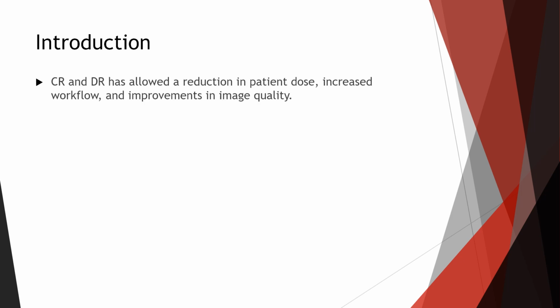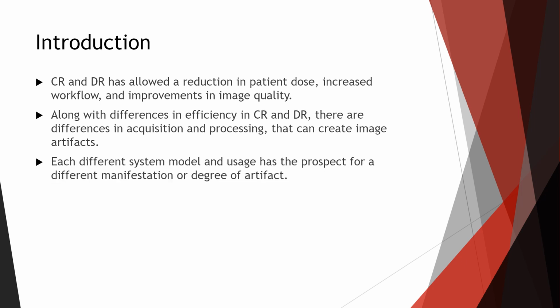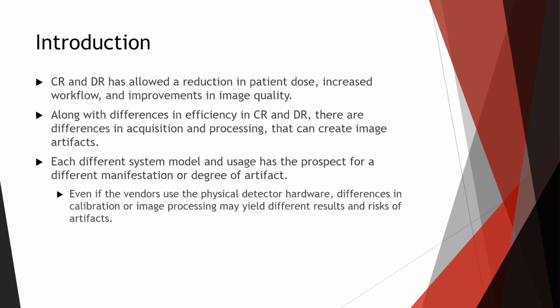We'll go through an introduction. CR and DR have allowed a reduction in patient dose, increased workflow, and improvements in image quality. Along with differences in efficiency in CR and DR, there are differences in acquisition and processing that can create image artifacts. Each different system, model, and their usage has the prospect for a different manifestation or degree of the artifacts we'll be discussing. Even if vendors use the same physical detector hardware, differences in calibration or image processing may yield different results in risks of artifacts occurring.